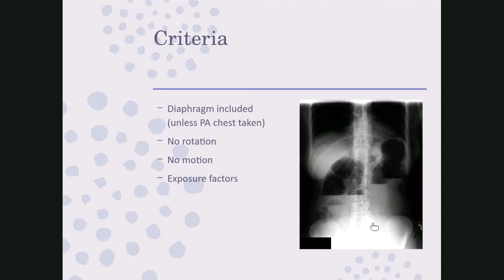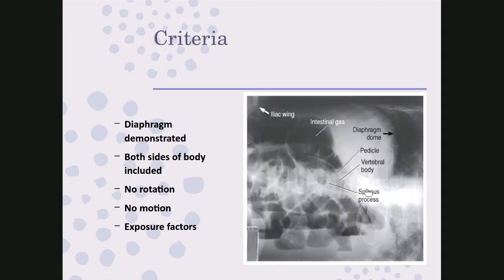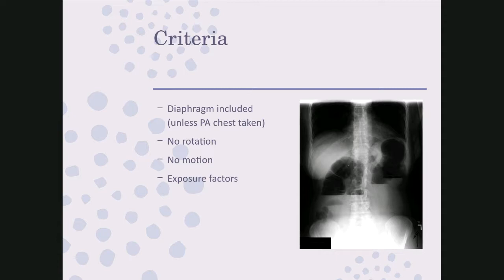And again, we have this distinct line that shows us air fluid levels. So you've got air up top. Any fluid would be on the bottom because air tends to be radiolucent. Fluid tends to be more radiopaque. So you definitely can tell that this was done upright because of those sharp lines, similar to when we did the decubitus view, and you've got these distinct lines. If you didn't have distinct lines, then the image probably was not done upright or in a decubitus position.